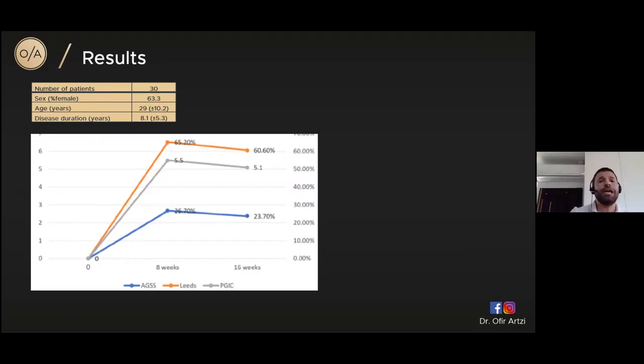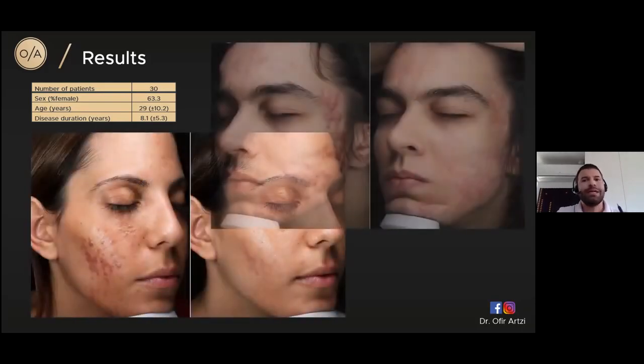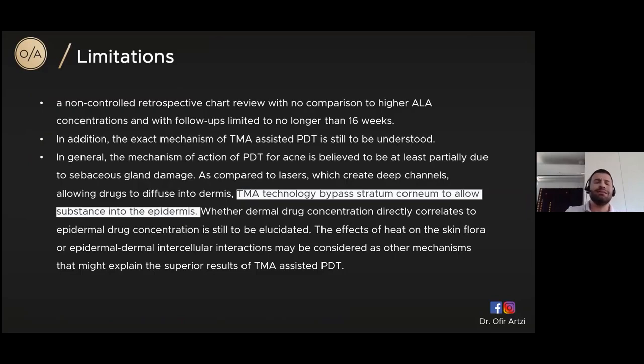and you can see the change. So if you look at all scales 8 weeks after the last treatment, and we did between 1 to 3 treatments, you can see we have a dramatic change which is maintained, and you can see the clinical picture. My experience, and again, this study has many limitations.